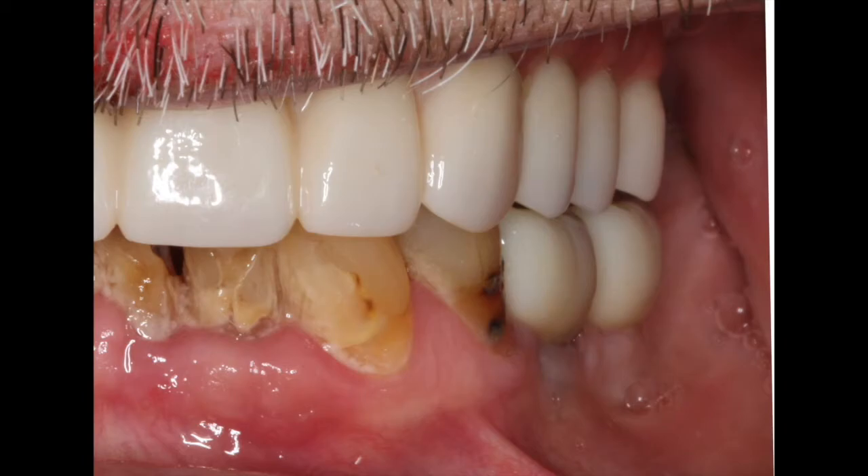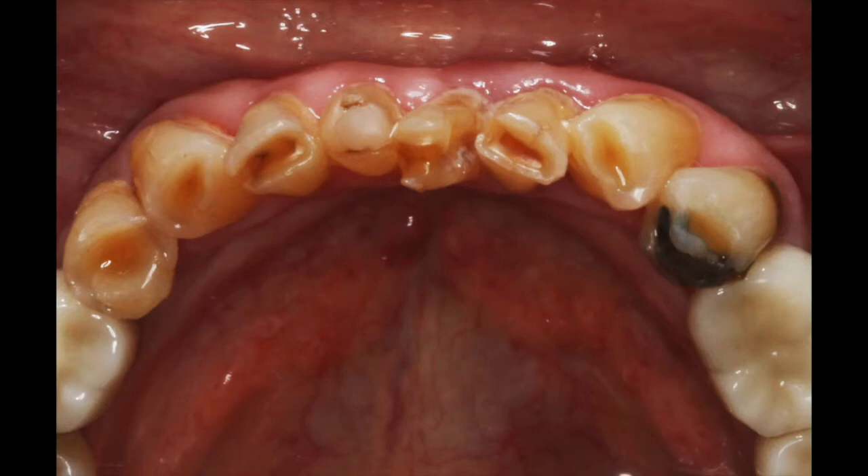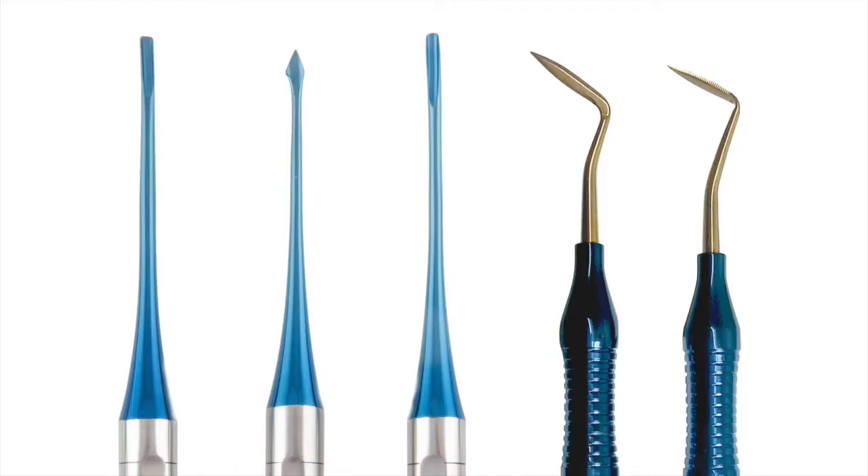We want to atraumatically remove these non-functional teeth, and we have several instruments from Golden Dent that I like to use. We have a separator, a bayonet, and serrated blades that help me make very precise incisions in the area so that I can prepare the site appropriately and as effectively as possible.